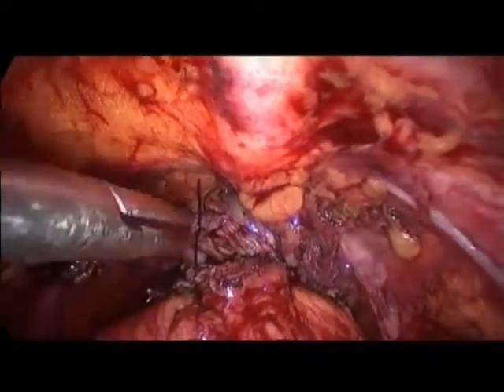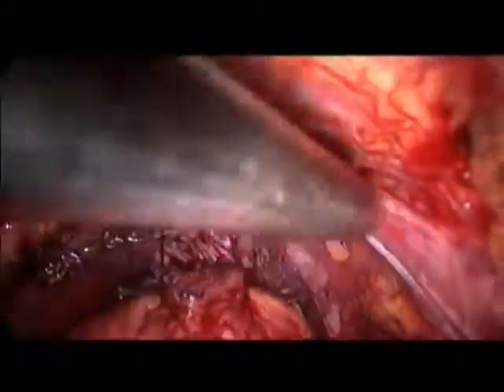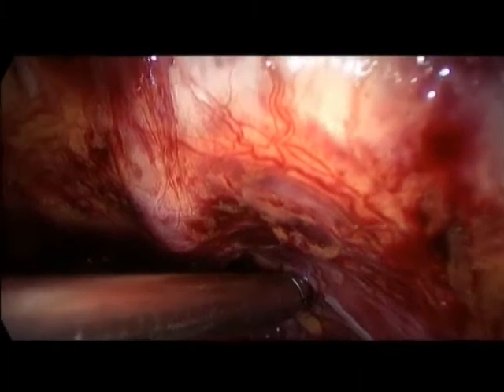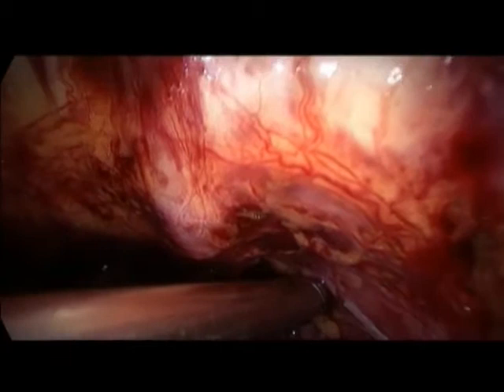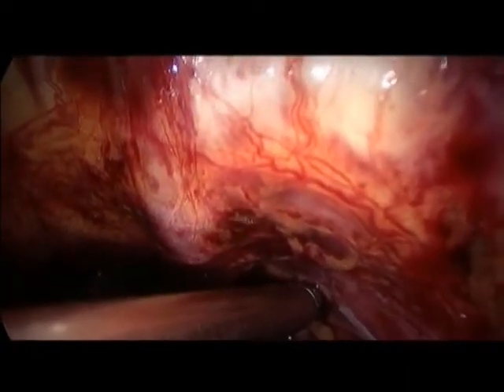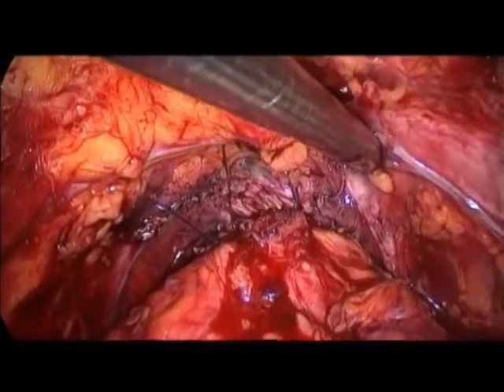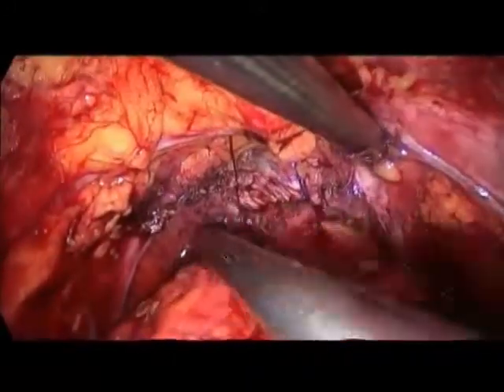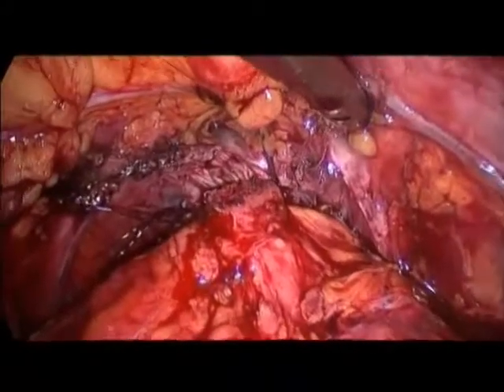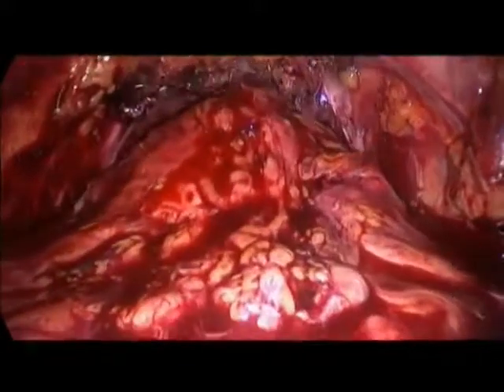Would you do a flexible cystoscopy in case you are in doubt? Yes, I would do that. Not too stiff. It's again elastic. Yeah. Maybe it's better. We'll see. Gel. No, it's okay. I'm watching the direction. So what are you doing at the moment? I'm catheterizing. So you are just putting in the catheter at the moment? Yes. And it doesn't pass in or out.